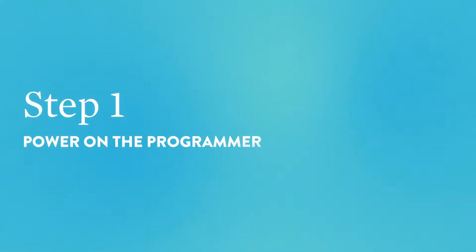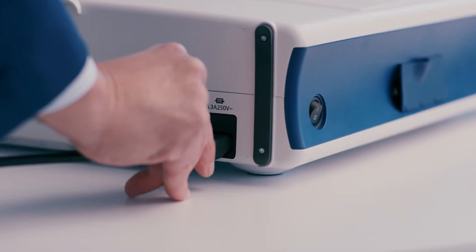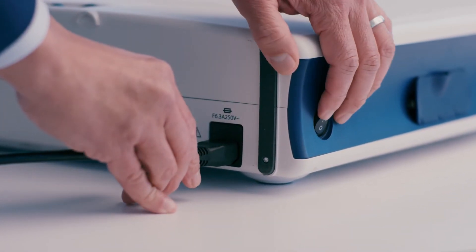Step 1: Power on the programmer. Plug in the power cord and press the on-off toggle on the left side of the programmer.